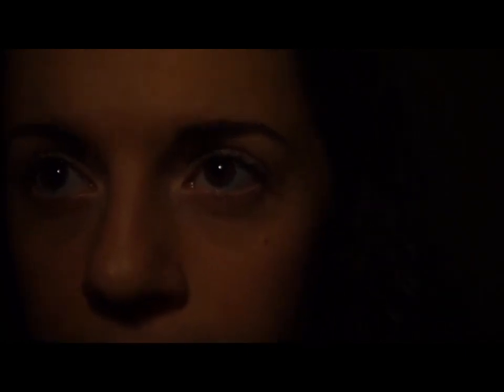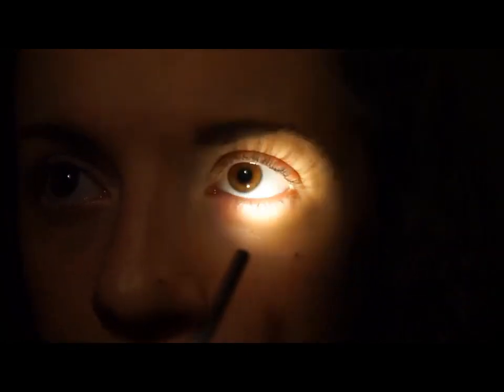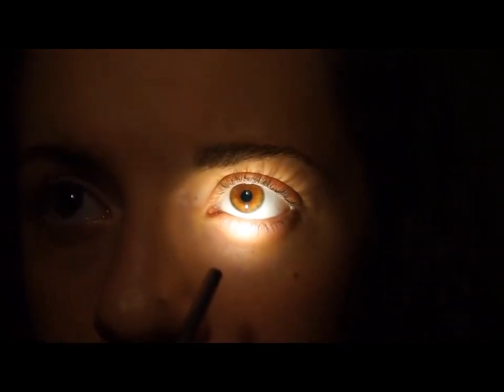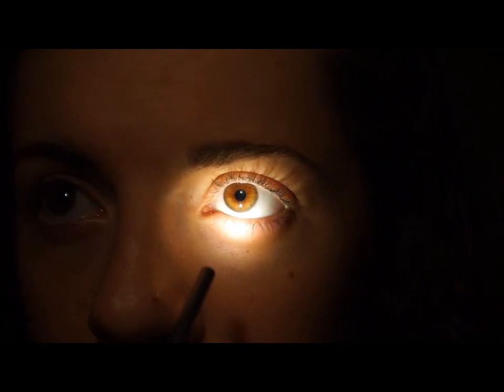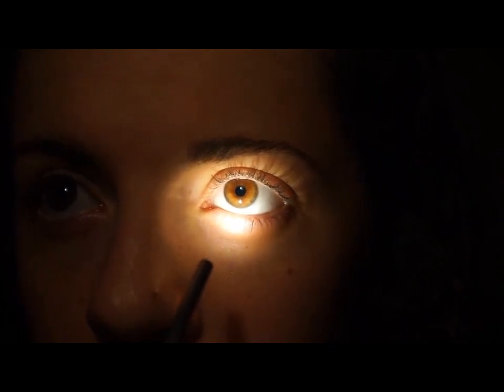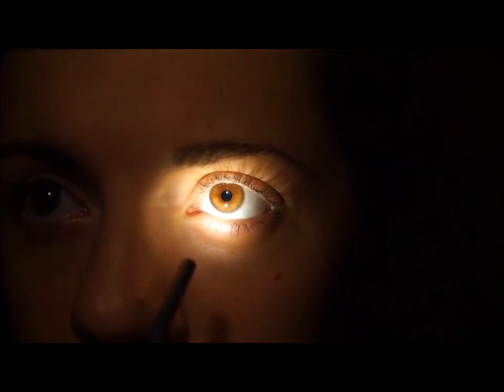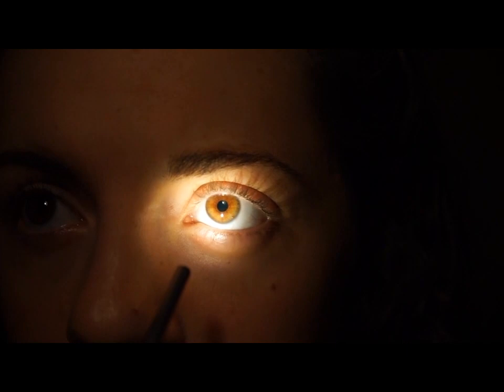Let's look at her other eye because hippus will be bilateral. You'll see it do the same thing. It constricts, it relaxes, and it's kind of bouncy in size — it gets larger and smaller under steady illumination.